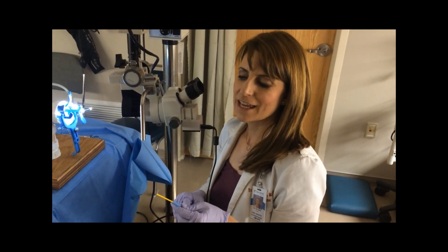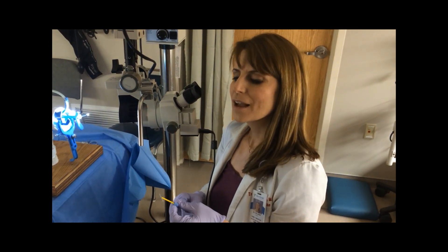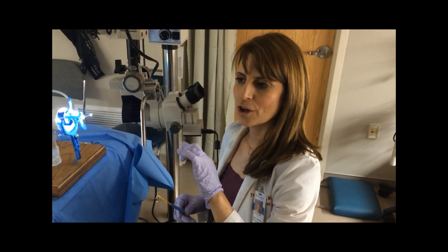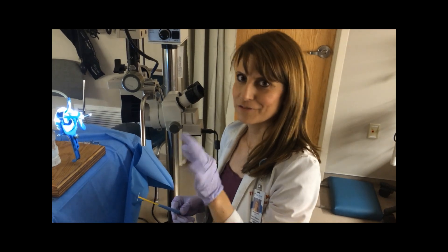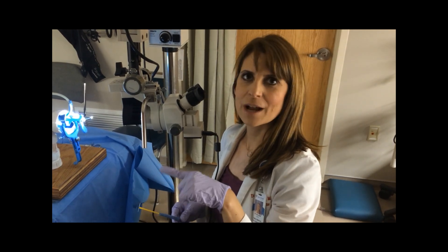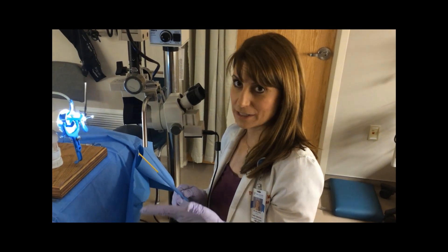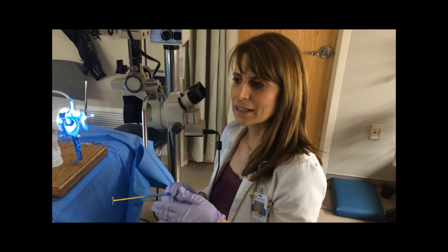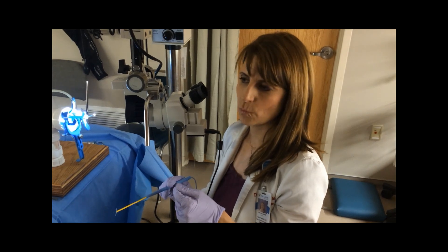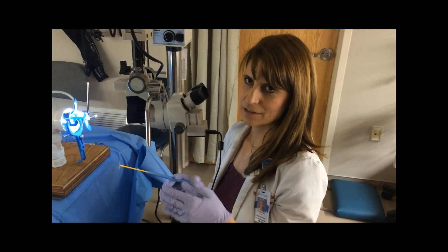The next thing I'm going to demonstrate is a LEEP using what I refer to as a regular loop electrode. There are many women that the Fischer is not appropriate for. After people have had babies, the cervical os can be more of what they call fish mouth, so it can extend from one side of the cervix all the way to the other side. If you try to do the Fischer, it comes out in multiple pieces. This is another type of loop that's very reasonable to use. Remember when you're doing a LEEP that you're trying to excise the entire squamo-columnar junction, and at times you're going to have to take more than one pass.